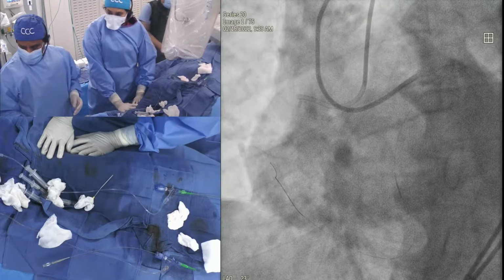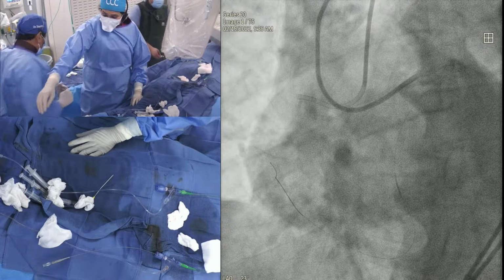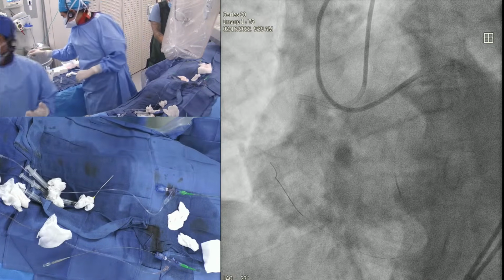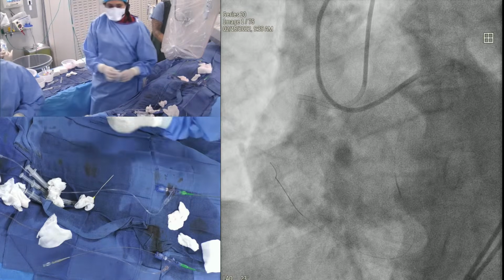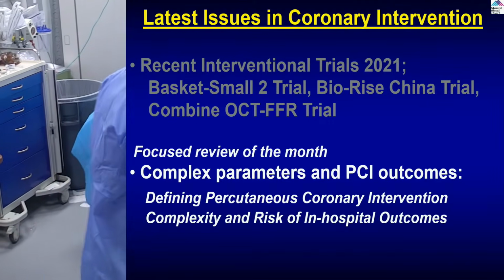Otherwise, I know we've been calling it a day for a very long time, but after this, really done. Yeah, so let's go quickly so I can finish at least part of the presentation, and in the end we'll just show. Okay, let's go to the slides, please. You have another Scion. We are going with the antegrade now.